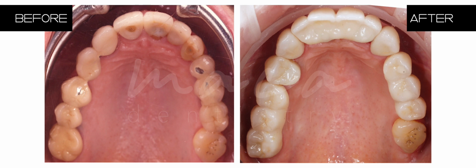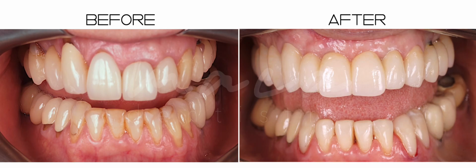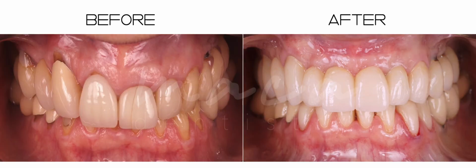First in occlusal view. Front view with the teeth open. Also we did some restorative work on the lower, in this case direct composite restorations and bleaching. Front view with teeth closed. Here you can see an important improvement in the bite as well.